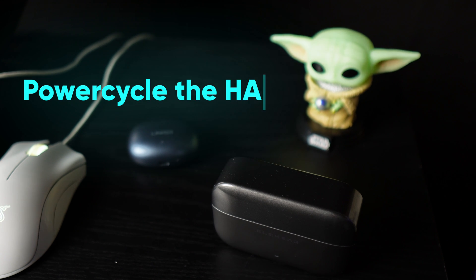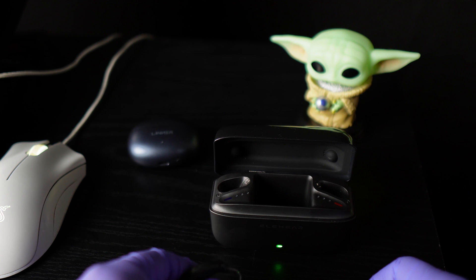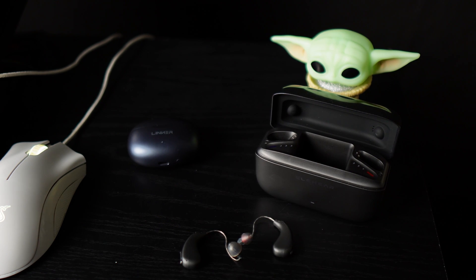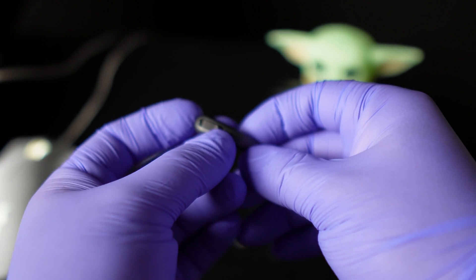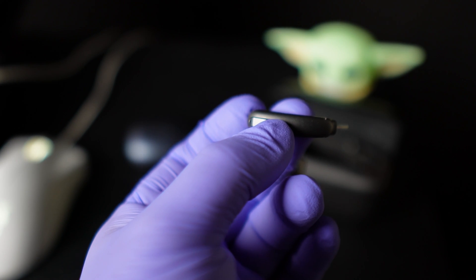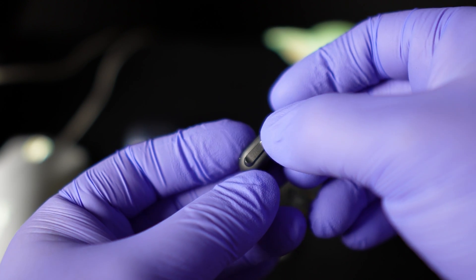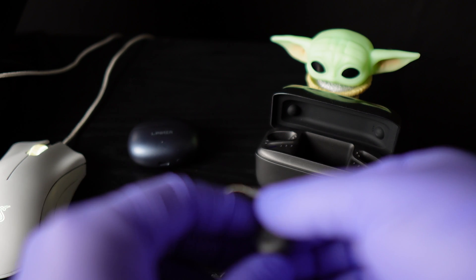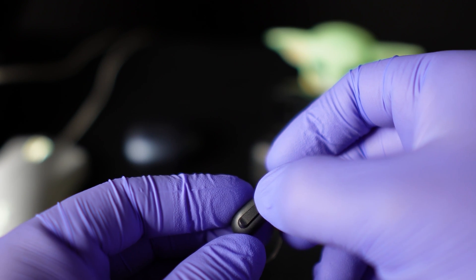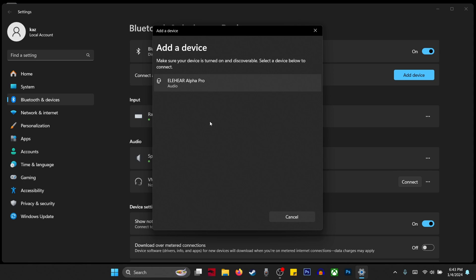To free up that connection, I can either unpair them from my phone or just shut off Bluetooth temporarily so I can connect them to my laptop. I've turned off Bluetooth on my phone, so these hearing aids are not connected to anything. Now I click Add Devices under the Bluetooth menu, then select the top option — the one that says Bluetooth. Then shut the hearing aids off and turn them back on. For rechargeable hearing aids, that means putting them in the charger and pulling them back out. As soon as they powered back on, the EleHear Alpha Pro popped up on screen — I select it, and we are connected.